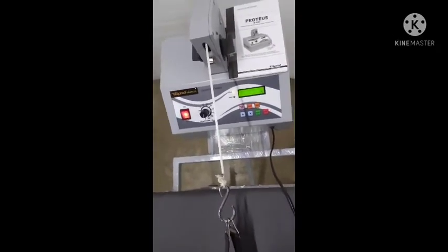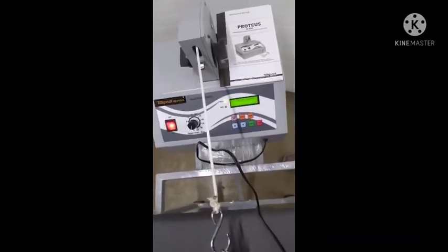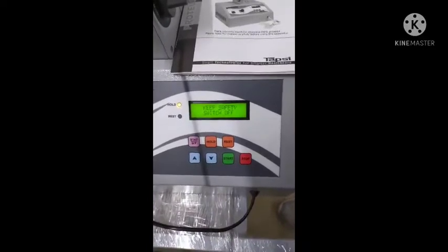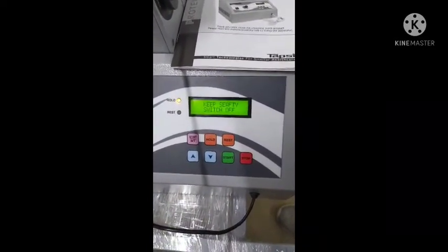If the patient switches on the emergency key, the display panel shows this kind of message: keep safety switch off.